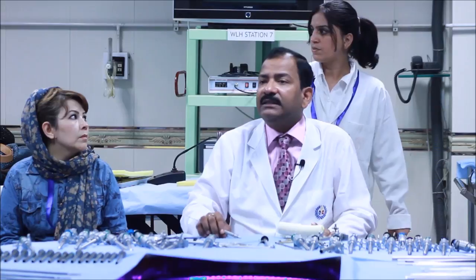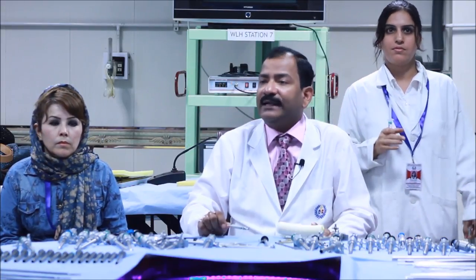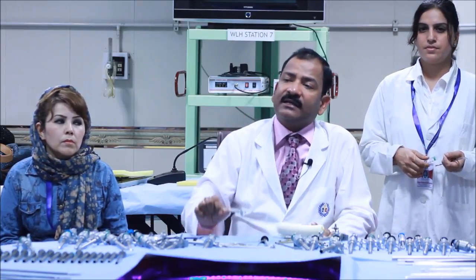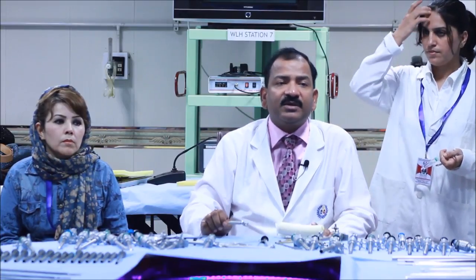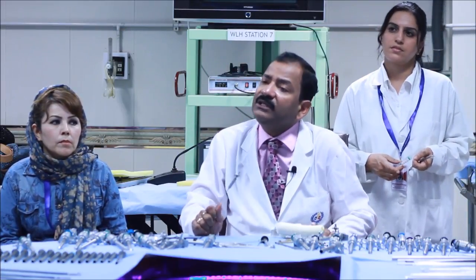Puncture, I am not discussing the site. Why am I not discussing the site? Okay. There are five sites of access. One is supraumbilical, infraumbilical, superior crease, inferior crease, and transumbilical. Yeah. Puncture site and Palmer's point. Puncture site I will not discuss because right now I am discussing only instruments. So, puncture site I will discuss in a separate presentation, which is called access technique. Okay? At that time, yes, what is your question?